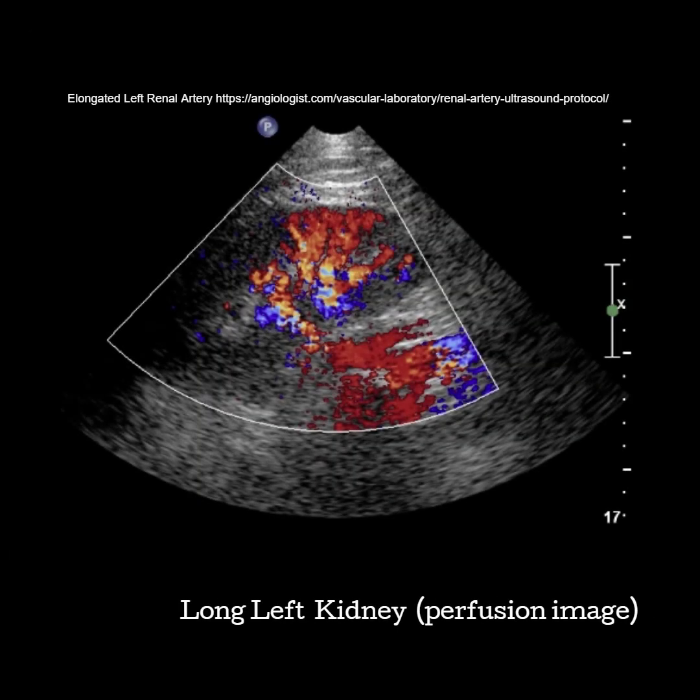Grab another color picture to show perfusion. Again, you'll be slightly oblique through the kidney as we want the hilum to show the renal artery and vein, but we want the mid portion so we can see more of the peripheral vasculature. Open your color box to cover the entire kidney. Try to keep your kidney horizontal as possible to make sure that the Doppler shift can be detected throughout the kidney. You can see in this image that the angle of the kidney is making it look like there isn't any blood flow to the superior pole.